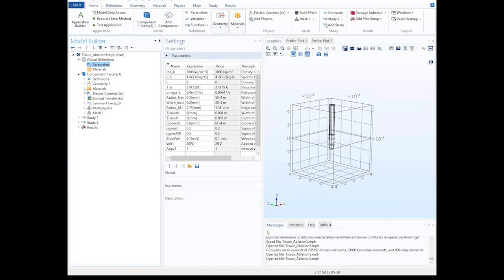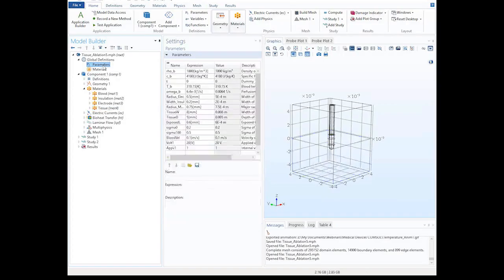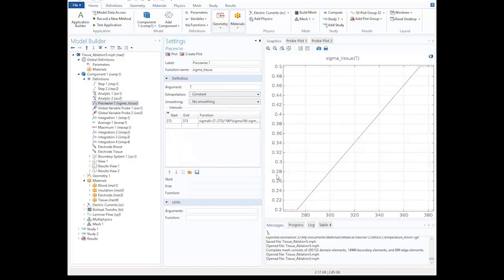Then let's see the materials. There's blood, insulating material around the electrode itself, and the tissue. And for the tissue, you'll see for the properties, the electric conductivity has an equation. Sigma tissue is a function of T, the temperature. That function is defined here, a value basically at 0 degrees and a value at 100 and linear interpolation between them. It could be anything else, but it does vary significantly over a 0 to 100 temperature range.